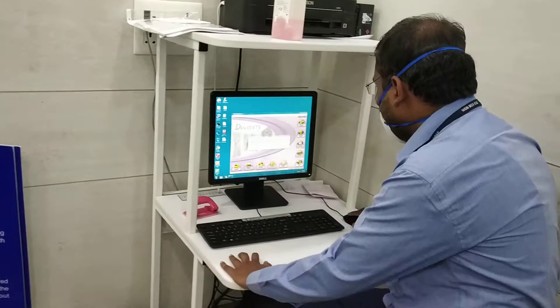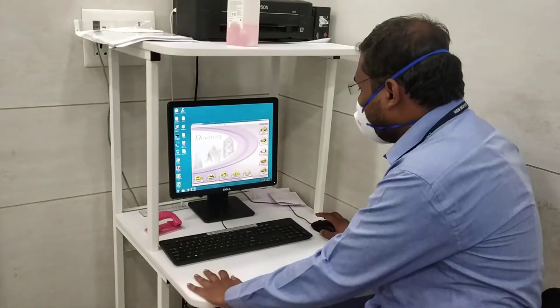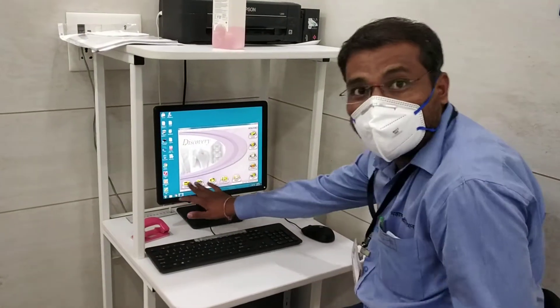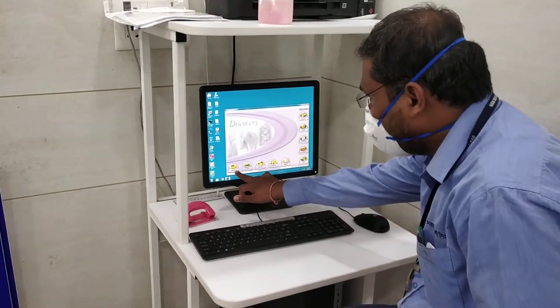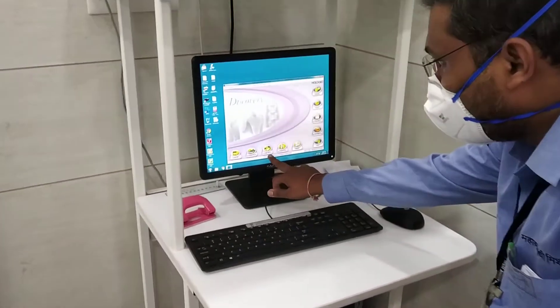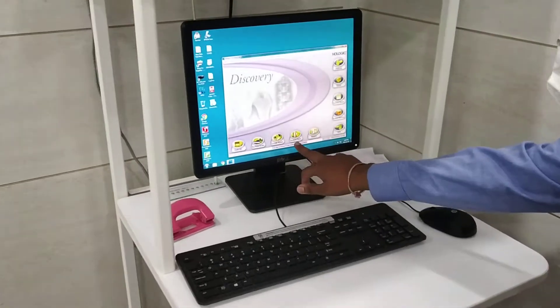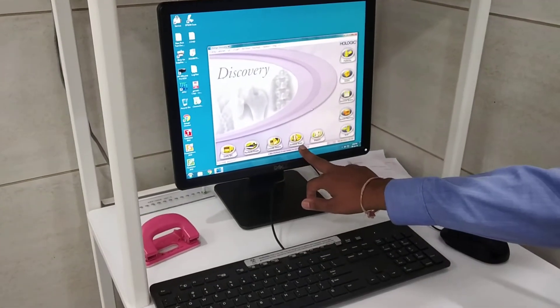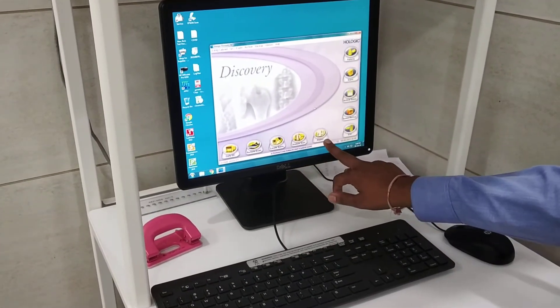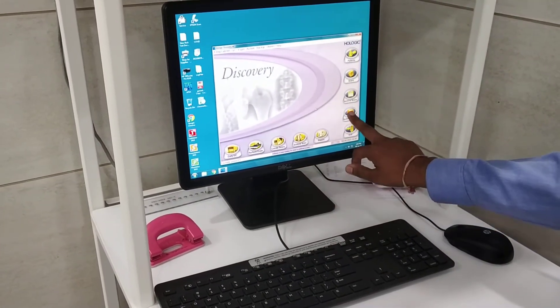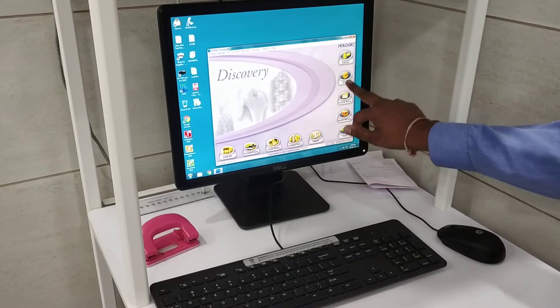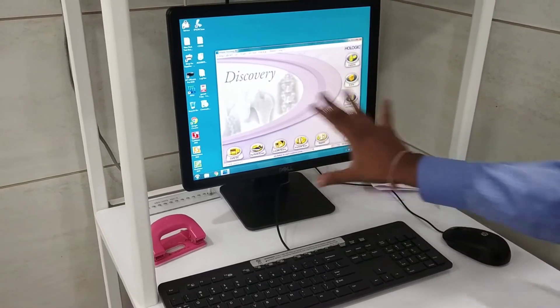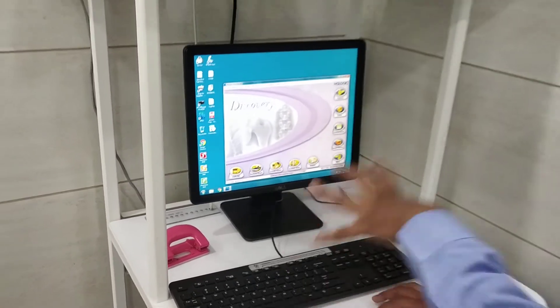Now you can observe these are the different options here: Daily QC, Perform Exam, Locate Scan, Analyze Scan, Report, Exit System, Backup, Archive Scan, Scan Patients — a lot of things are there for this machine.